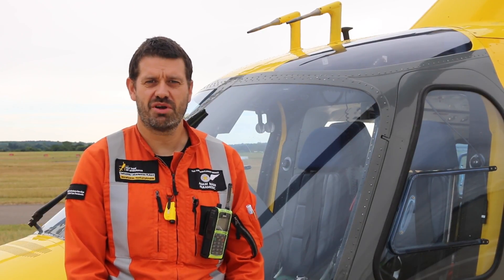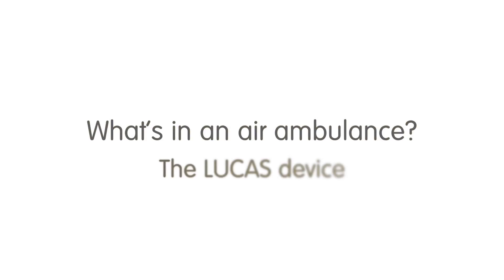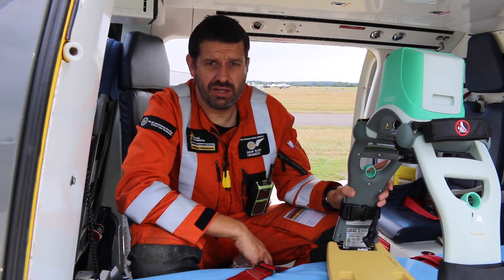Hello, I'm Adam, the critical care paramedic. Today we're going to be looking at the Lucas device. So this is our Lucas device.